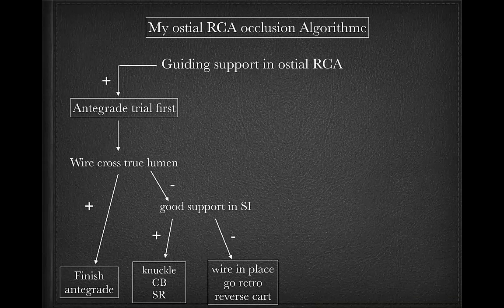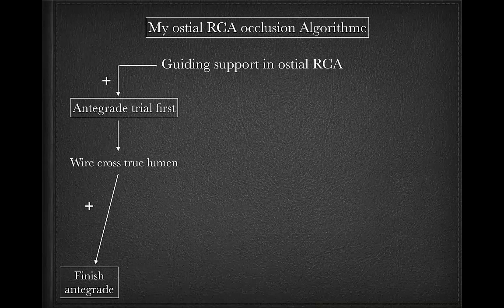I use it a lot in that kind of sometimes calcified, bending, curvy artery. It's a good wire to take the curve in all these situations. Then I was able to advance my FineCross and exchange for another wire. So my wire was able to cross true lumen, so then you have to finish.